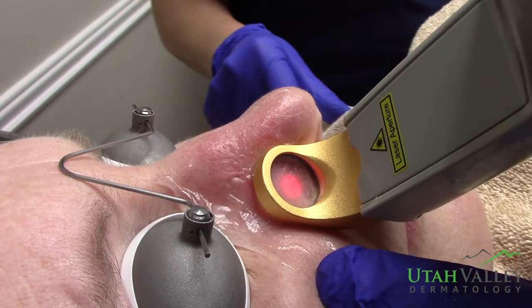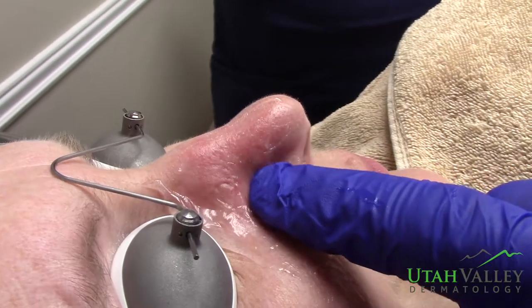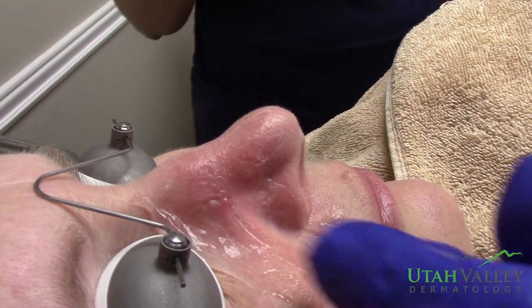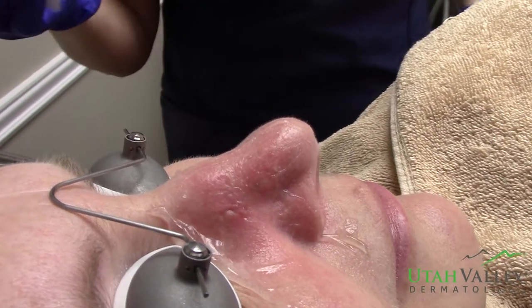They kind of turn a tiny bit gray if we get them right. Okay, awesome. Those are going to go away really good. Good job, girl.